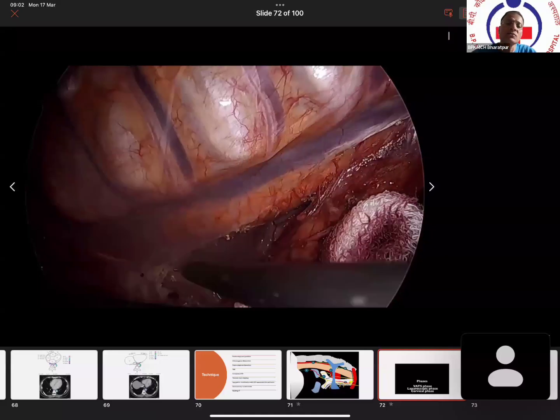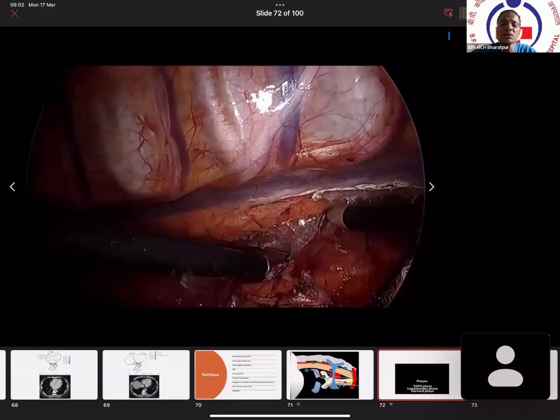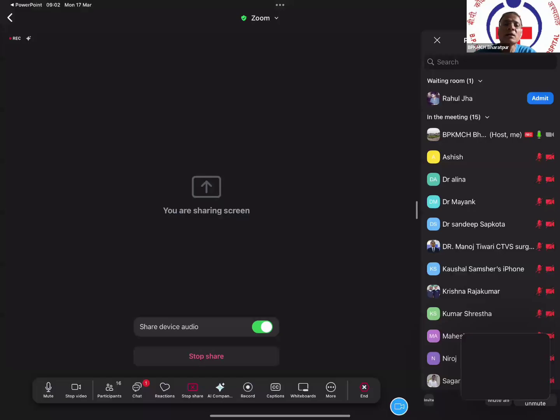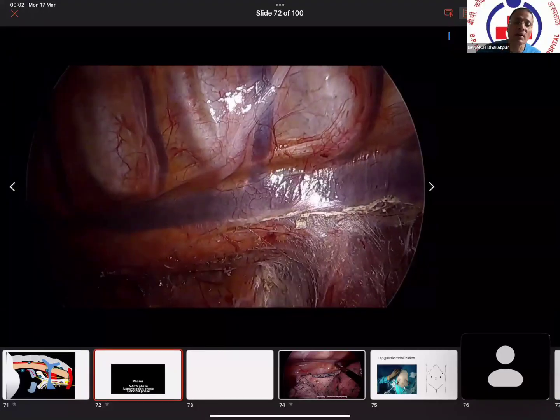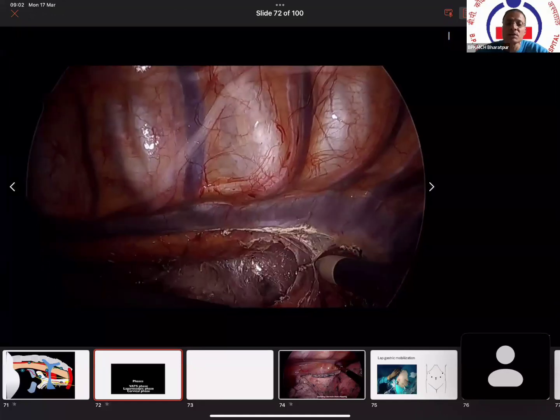In the chest cavity, we cannot take as much tissue as we wish because of the very important structures located there, like the aorta, the heart, and the trachea. So it may not be possible for us to dissect wider margins around all these structures. So this is how we go for the infra-azygous dissection, as shown in this picture.